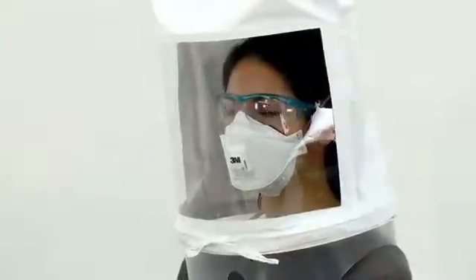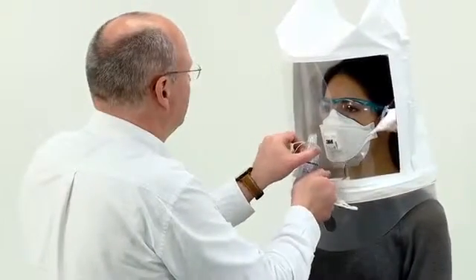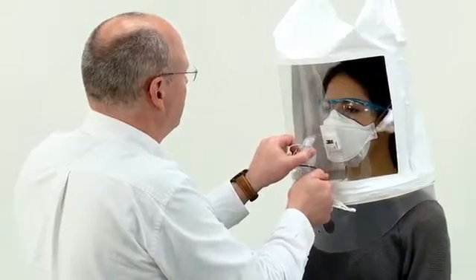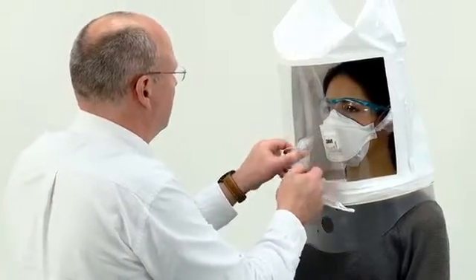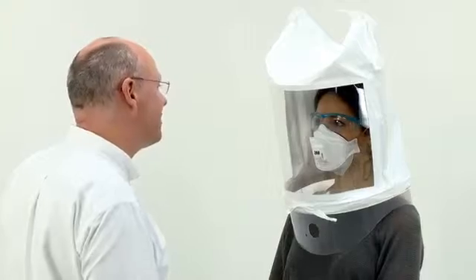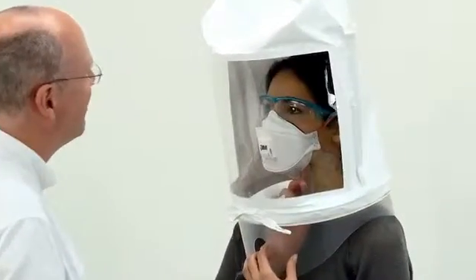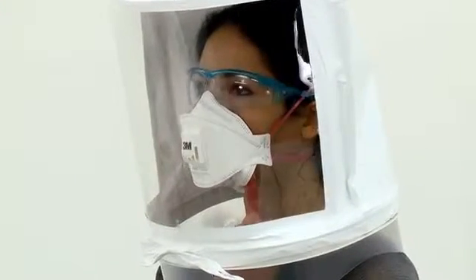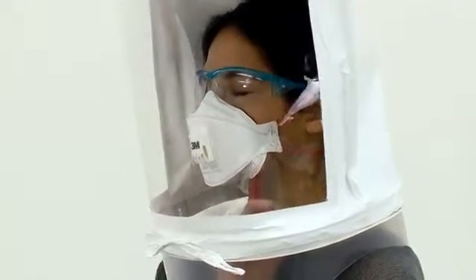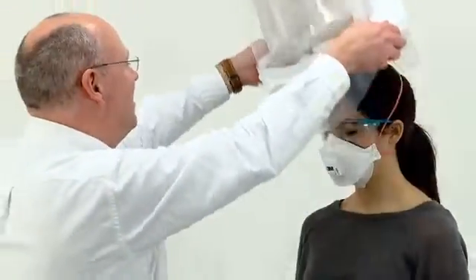Finally, ask the subject to carry out a minute of normal breathing. Remember to top up the concentration every 30 seconds. Once the subject has performed all of these exercises without tasting the mist, they have passed the test. You could at this point ask the subject to reach up inside the hood and break the seal of the respirator, followed by taking a breath. By tasting the solution, the subject will gain an appreciation of the protection provided by the respirator.